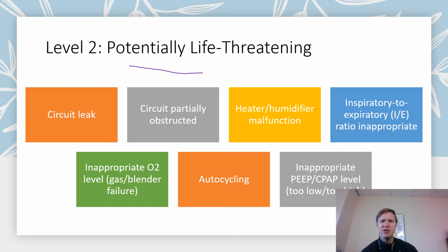And then too, inappropriate PEEP or CPAP levels. So if it's too low, all right, or too high, it's like, hey, are you sure you want to do this? This goes beyond normal physiological parameters that are regular, right, that are routine. So it's just alerting you. Just like the IE alarm, it's saying, hey, this is going beyond physiological parameters for most patients. Are you sure, right? And it's there to help you understand that situation, right?